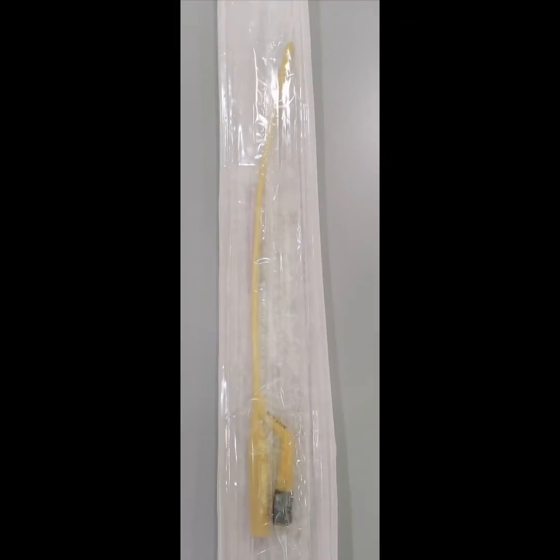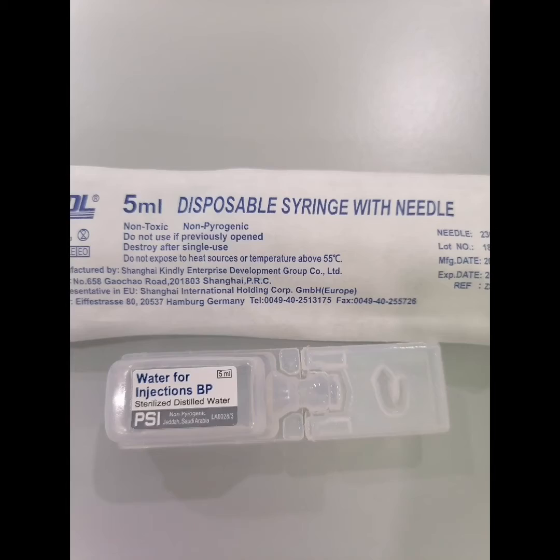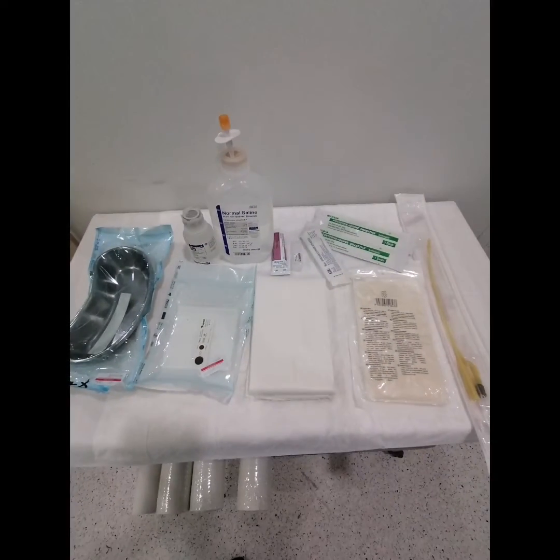Some radiologists prefer to use a urinary catheter. If so, also add a size 10 urinary catheter and 5 ml of distilled water in a 5 ml syringe for the catheter lock.